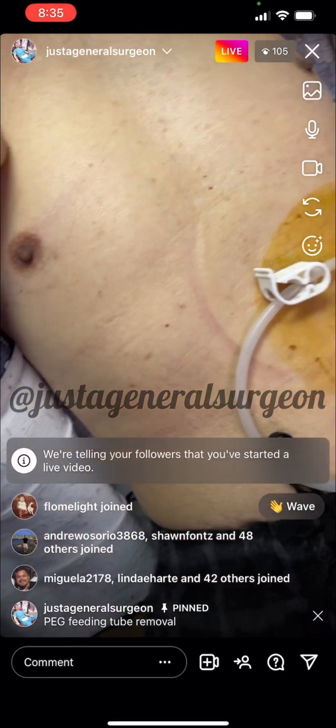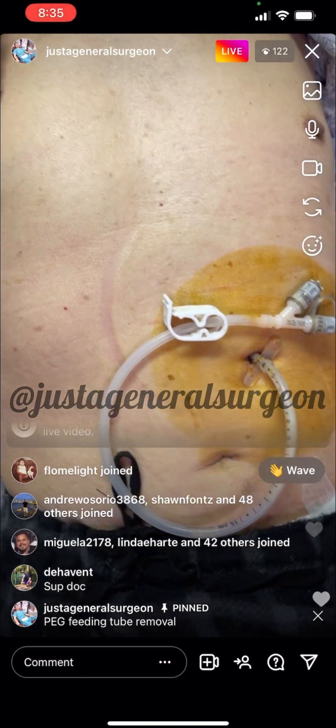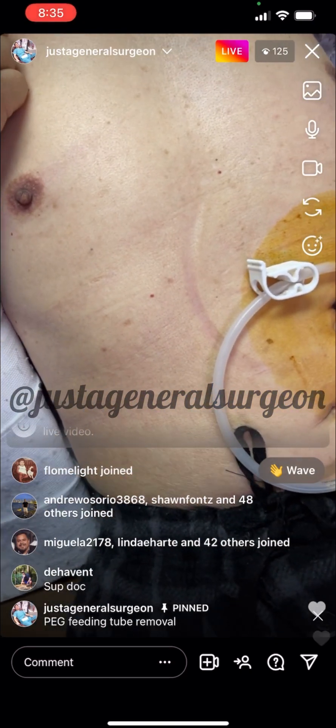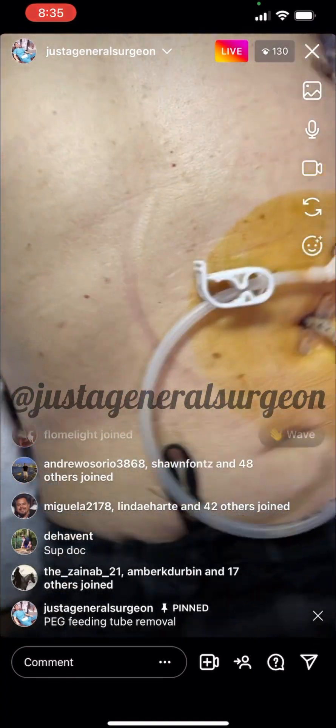Good morning everyone. We are going to remove this feeding tube here in the office today. Our patient was kind enough to let us share his story as to why he had this feeding tube placed, and to watch us remove it and show you how it's done.